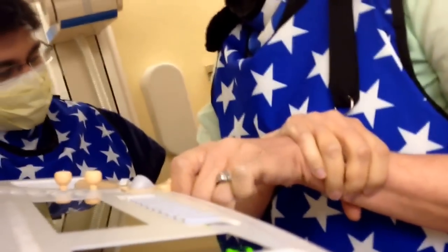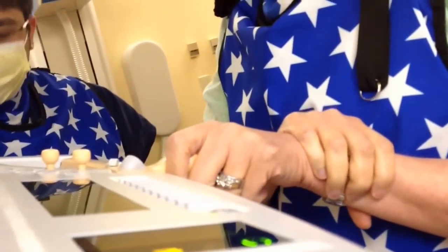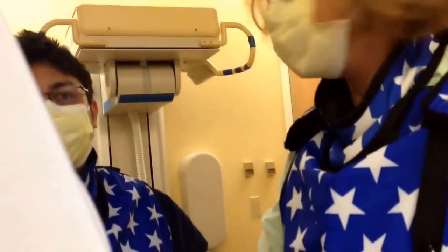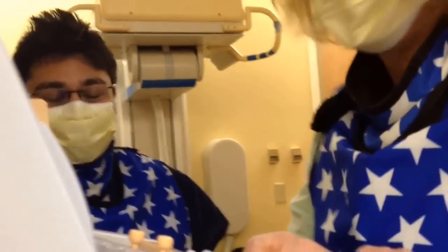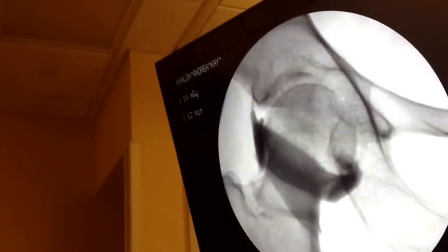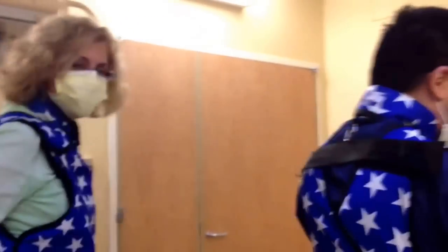It's bleeding a bit — I was going to hold some pressure. There was a little blood, apparently. Nothing bad. I do feel pressure under the skin. Thank you very much — it's all in there. Success!